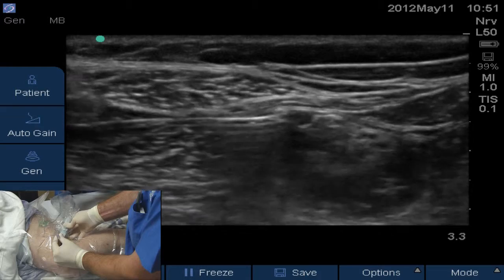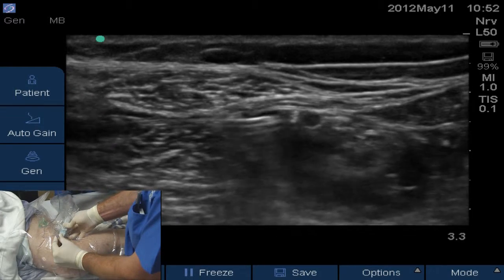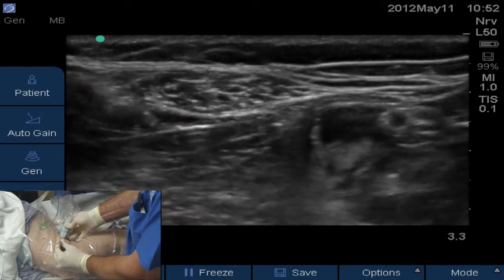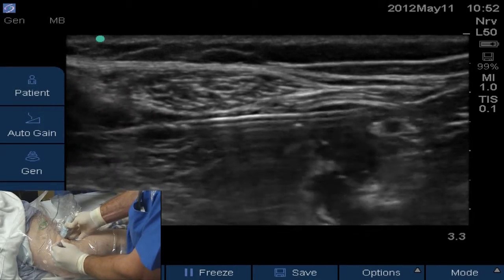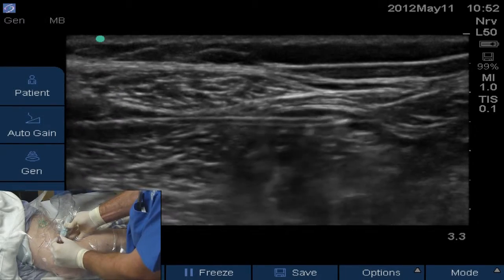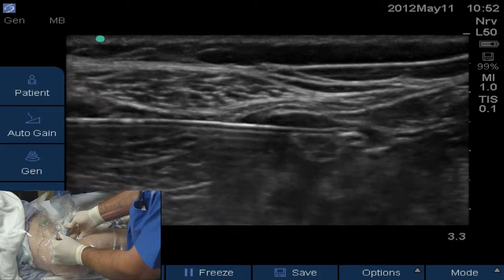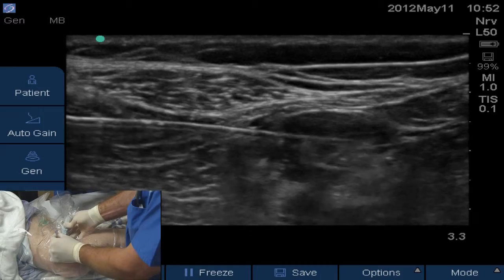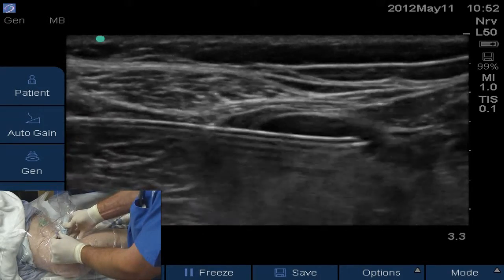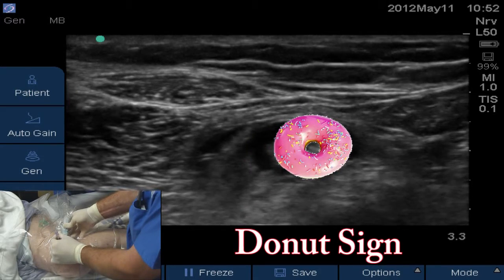I'm going to give another 5 cc's as I pull back and then go over the top of the peroneal nerve. 5 cc's there, then another 3 cc's as I finish going over the top of peroneal nerve. You can now see I've totally encircled the peroneal nerve with local anesthesia — like a donut all around the peroneal nerve.